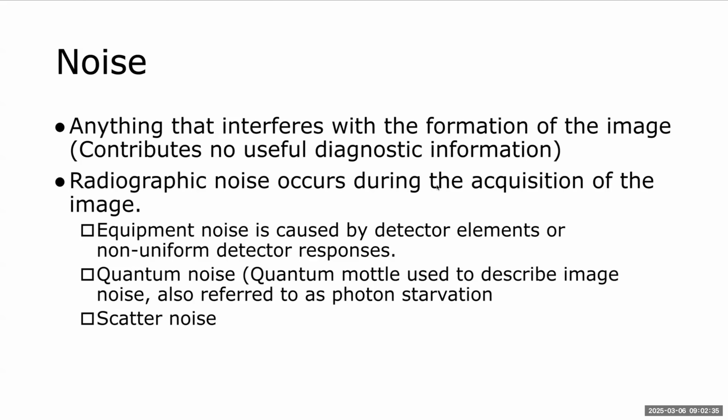The first thing you'd want to do when you came in on Monday was to erase those cassettes, because they did accumulate background radiation on them. Nothing we can do about that. We don't really have that issue with direct digital imaging, because those detectors are continuously refreshing, and so we don't really have that issue like we did with CR.